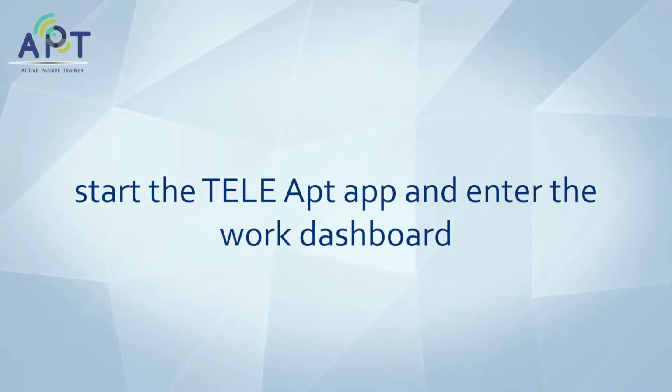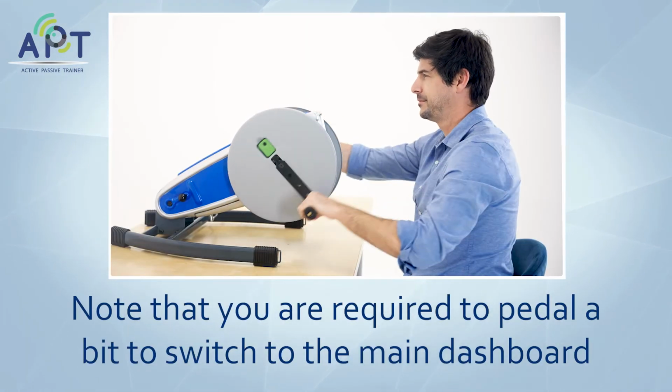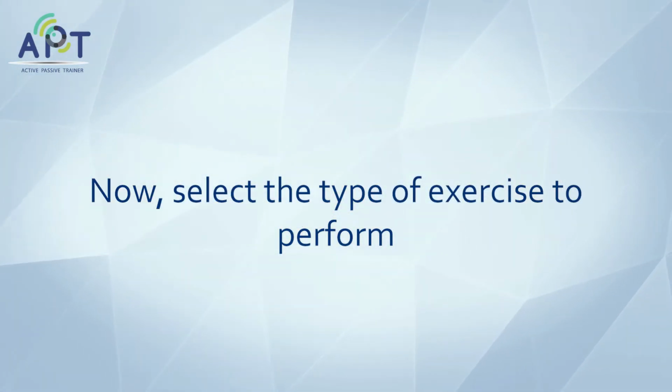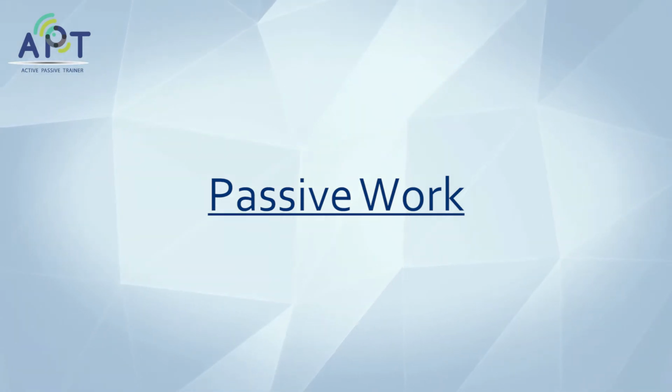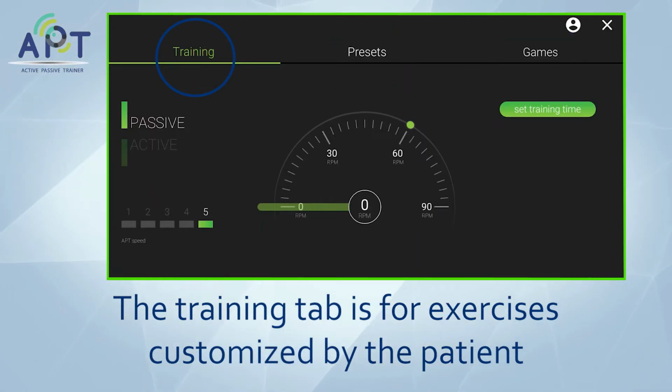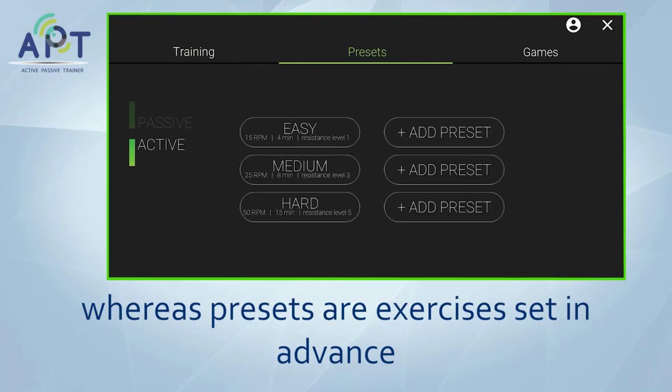Start the Tele A.P.T app and enter the work dashboard. Note that you are required to pedal a bit to switch to the main dashboard. Now, select the type of exercise to perform. Passive work. When the app starts, the top part of the screen displays the presets, training, and games tabs. The training tab is for exercises customized by the patient, whereas presets are exercises set in advance.